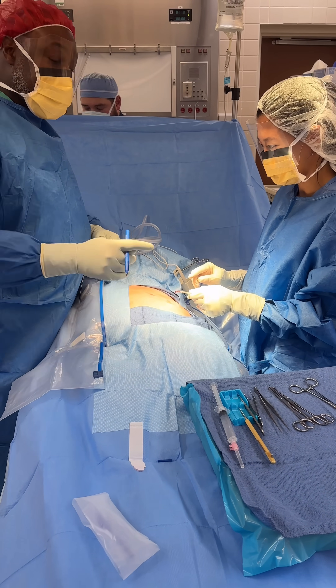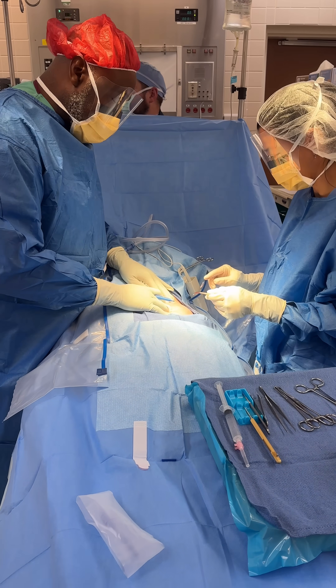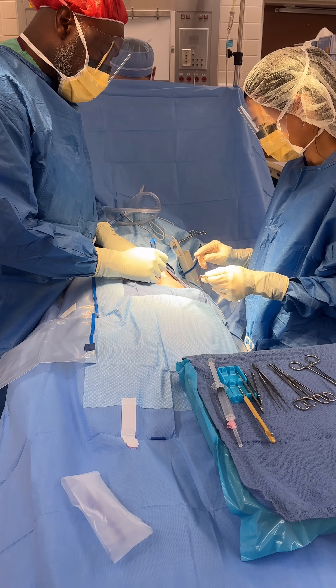What are you going to do? Wait a sec. You see how it's dug in, like right here? And now there's air and stuff coming out. So you're going to cut from here to here.